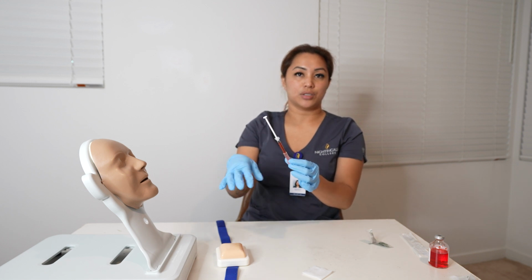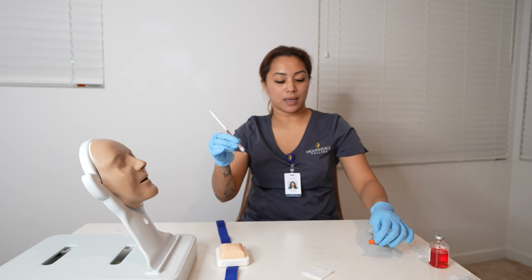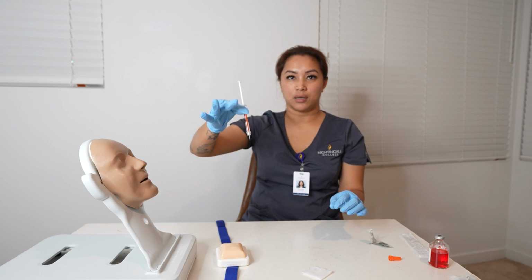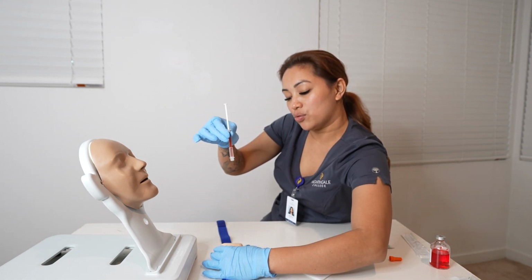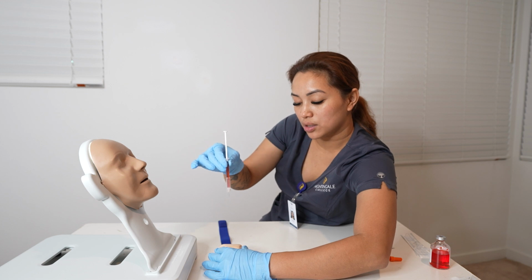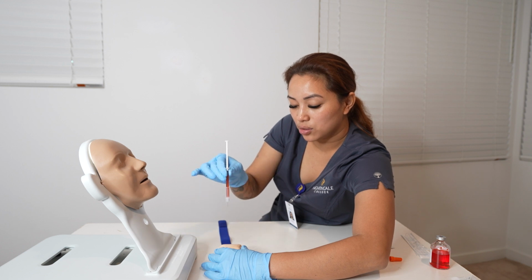Now I didn't touch the injection site, so now I am going to take out the cap. I'm going to hold it like a dart at a 90-degree angle. This is Miss Smith and this is her belly. Now I'm going to grasp the belly, making sure that I am not holding the injection site since we cleaned it. Now I am going to go at a 90-degree angle. 1, 2, 3, Miss Smith.